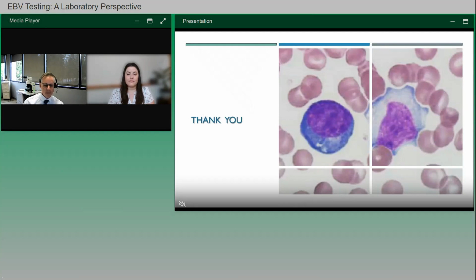The EBNA still lingers, and it does present there longer. But in about 20% of people, it's pretty low. So I would say, just based on experience, that the VCA IgG is probably a little bit better for past infection, but you can take both. Not sure there's a strong link for either one being more powerful. I just think VCA IgG is more common.